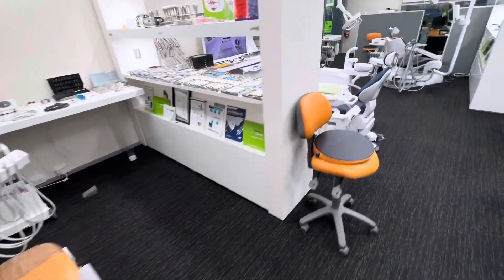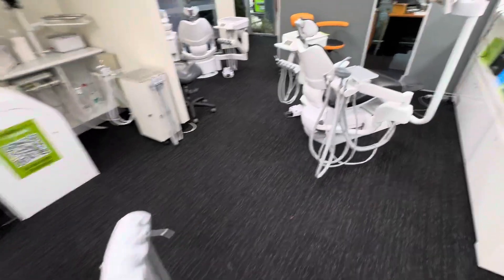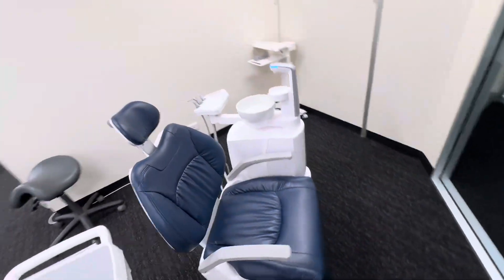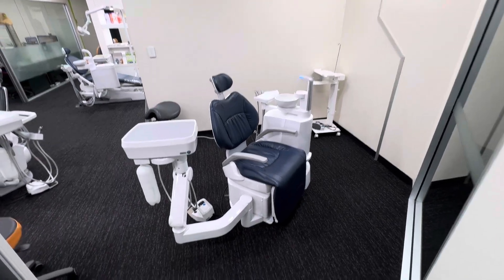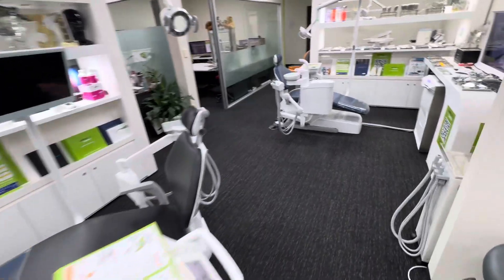Hi, it's Steve here from Leading Dental. I thought it was time for me to do a little bit of an overview of some of the chairs that we've got in the showroom here again. We love our Belmont range — Japanese made, 100% reliable, 100% Japanese made, so it's got the quality you'd expect from a Japanese product.